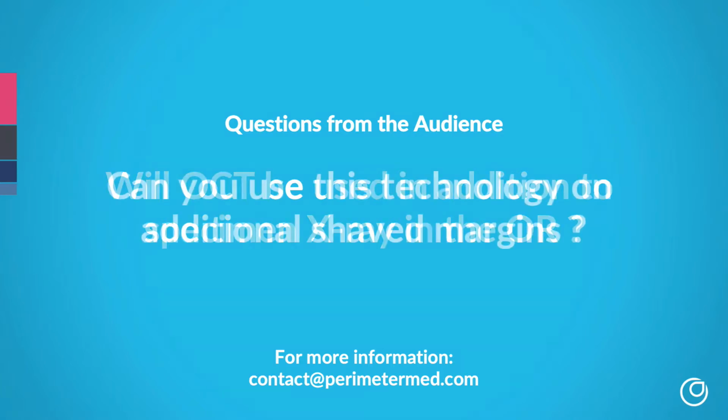Should we go on to the next? Can you use this technology on additional shaved margins? I would say definitely yes. This made up a significant portion of the data from both our phase 1 and phase 2 study. It's much easier because you don't have to reposition the specimen. You're only really interested in one side. Also, a much smaller amount of data to look through. But I would say very useful, just as much so as on the primary lumpectomy specimen. Agree. Yeah, I'd agree with that.